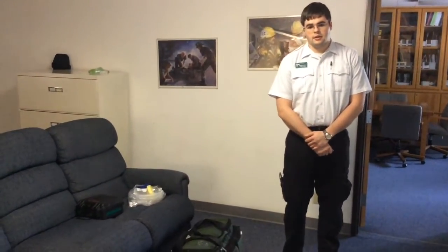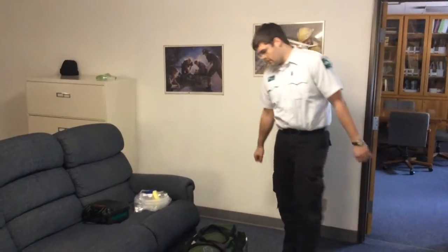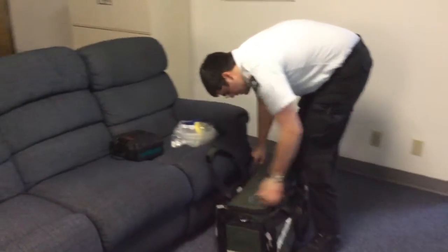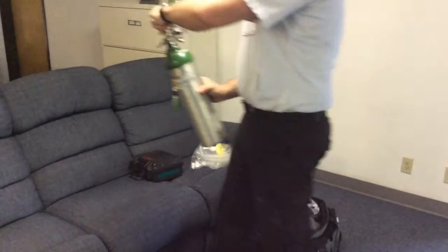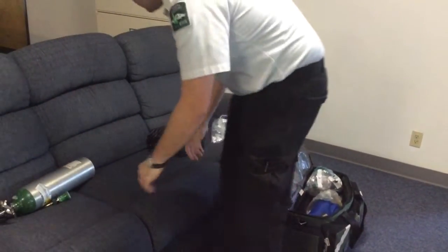We are now going to be setting up CPAP in the field, away from the ambulance. The setup of the CPAP itself is the same, except we are going to be using a portable O2 bottle. There are two bottles in the kit. Start by taking one out, turning it on, and setting it aside where it cannot tip over.